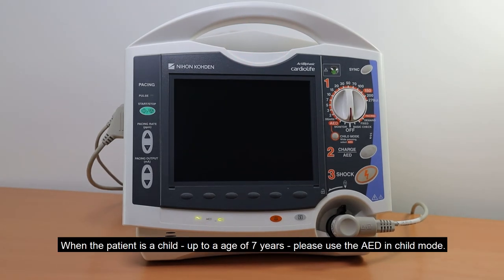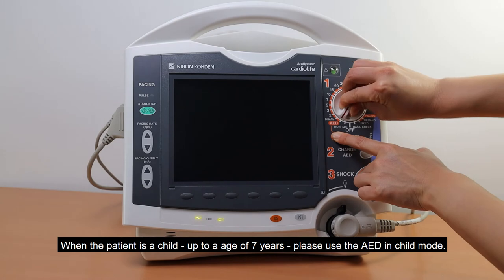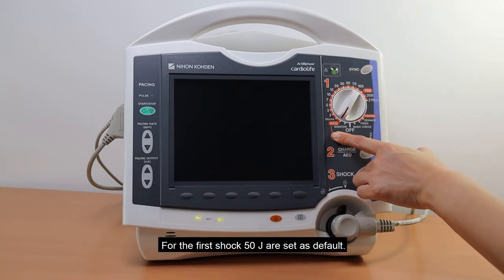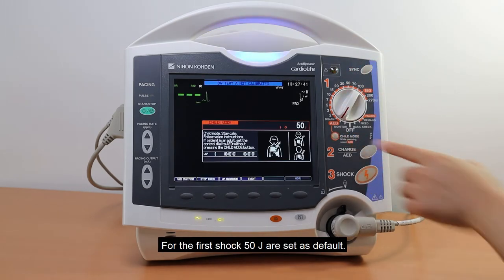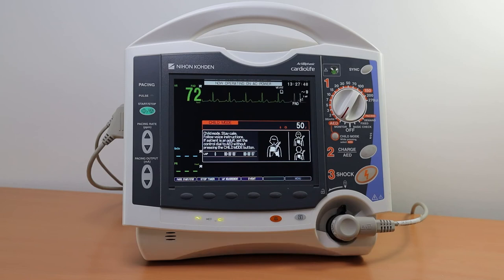When the patient is a child up to an age of 7 years, please use the AED in child mode. For the first shock, 50 J are set as default. All energy levels can be changed in the system setup. If the patient is an adult, set the control dial to AED without pressing the child mode button.